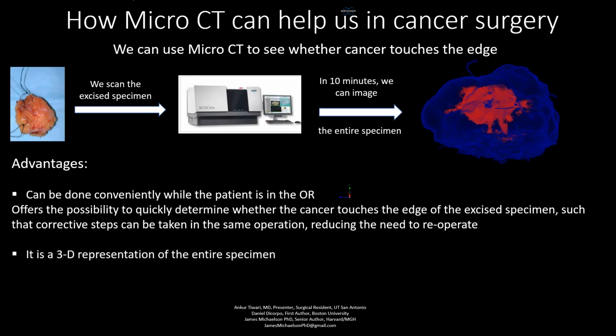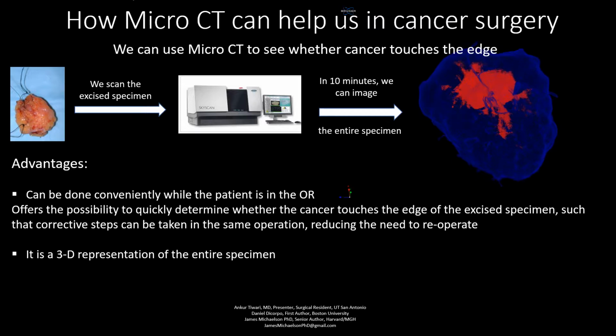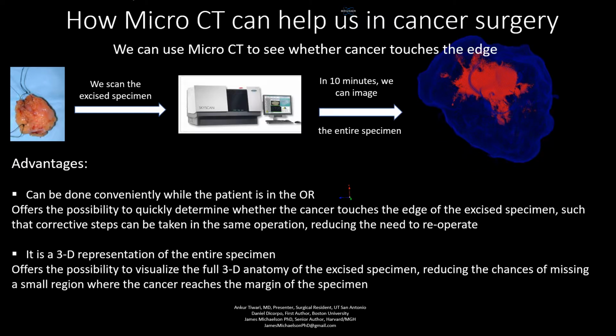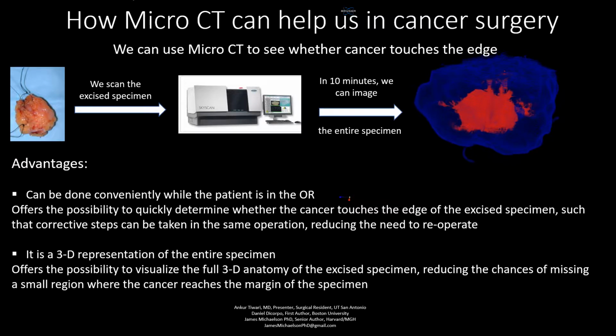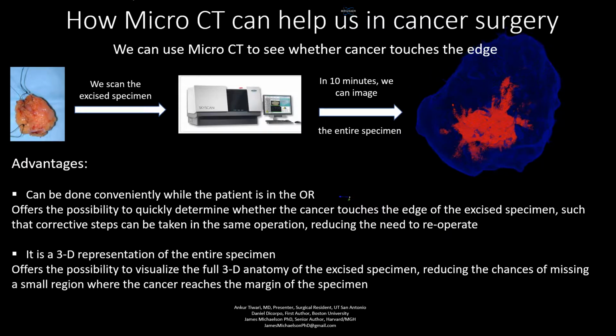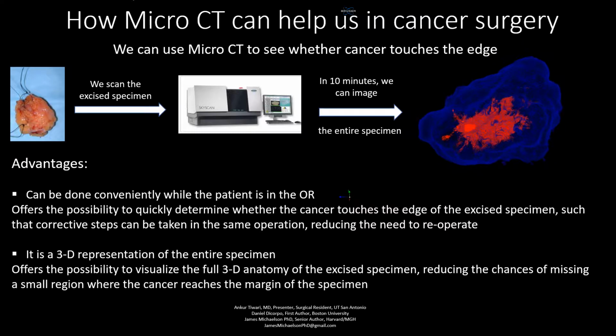Also, since it is a 3-dimensional representation of the entire specimen, it offers the possibility to visualize the full 3D anatomy of the excised specimen, reducing the chances of missing a small region where the cancer may reach the margin of the specimen.